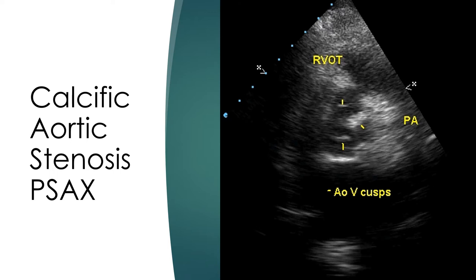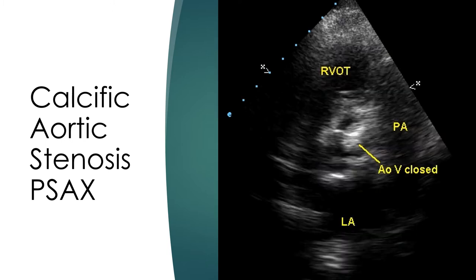The markers show the leaflets. The commissure between the left and right coronary cusps appears fused and thickened. RVOT – right ventricular outflow tract; PA – pulmonary artery. Parasternal short axis view at the level of the aortic valve showing the aortic valve in closed position with significant thickening and calcification. The valve appears tri-leaflet rather than bicuspid.